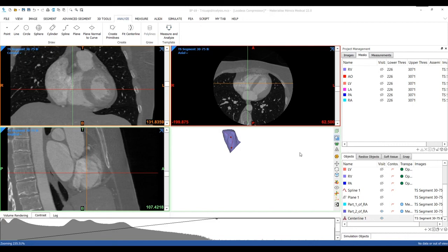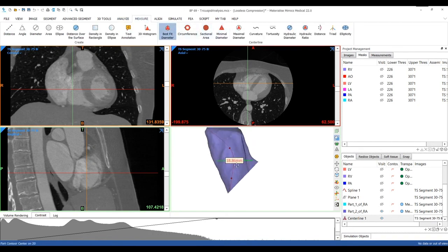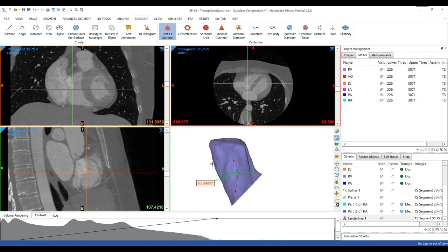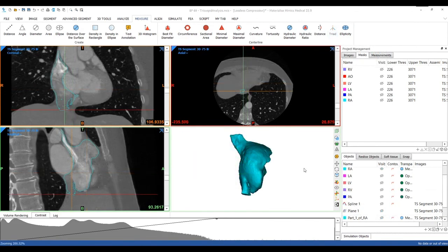Based on this centerline multiple measurements can be performed, for example the best fit diameter and the sectional area. These measurements are made at every location perpendicular to the centerline. Also the length along the centerline, the curvature and other measurements can be performed. Another important measurement is the angle between the tricuspid valve and the vena cava. This angle is key to ensure that your catheter can reach the tricuspid valve. Let's use the inferior vena cava this time.